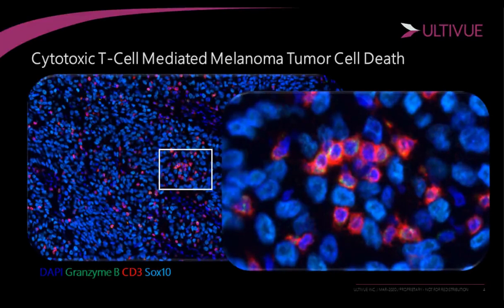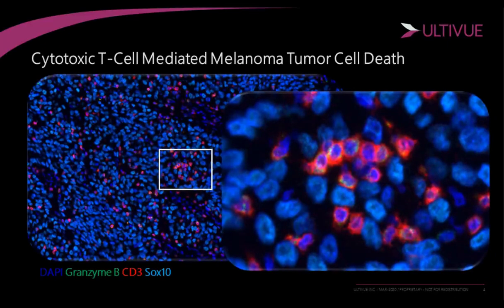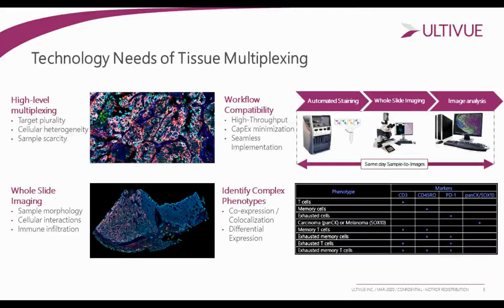What you're visualizing in red is the CD3-positive T cells clustered around a group of SOX10-positive melanoma cells. In the very center, you can see the membranes of the CD3-positive T cell that has Granzyme B polarizing to the lower membrane side abutting a SOX10-positive tumor cell. We can clearly see the immune recognition demonstrated by the alignment and flattening of these two membranes.